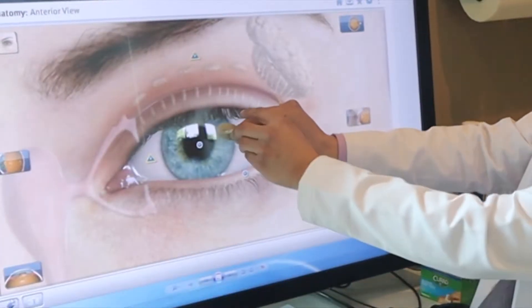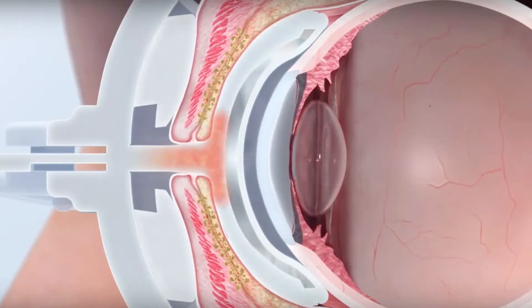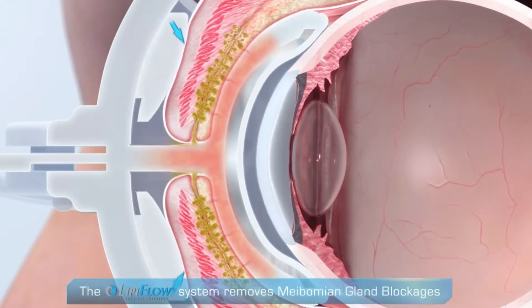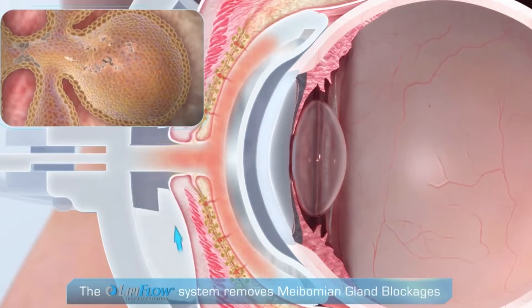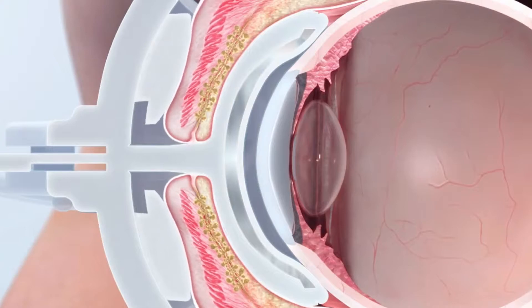There's actually a cable that attaches to the machine that creates air pressure, and it'll actually massage your upper and lower eyelids while the heating element on the device goes up to 108 degrees, and it does that for about 15 minutes — all while massaging the upper and lower eyelids from the inside out, clearing out any obstruction.